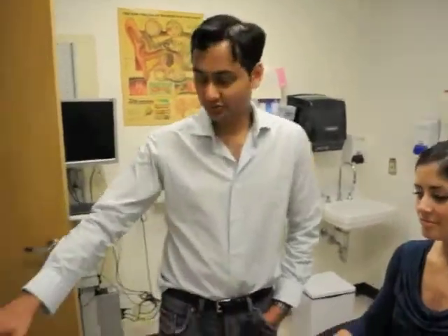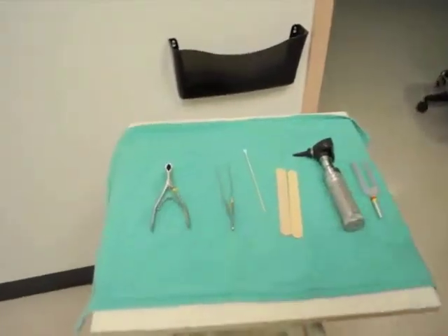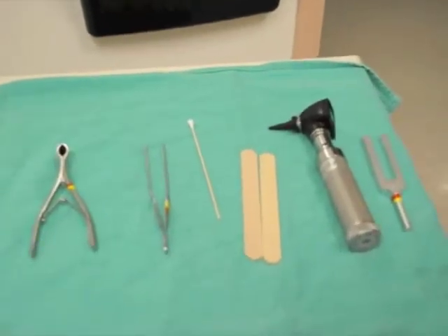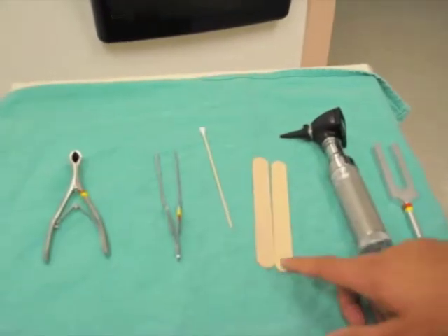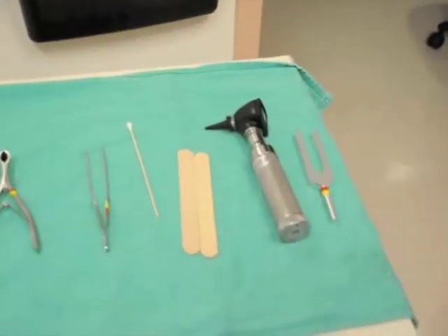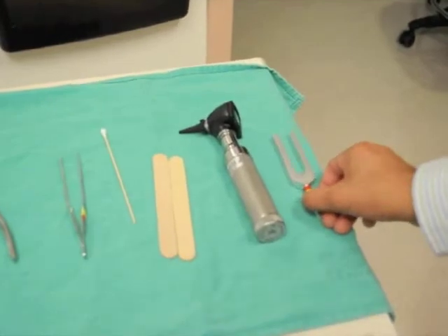We've selected a few instruments here for the Head & Neck Physical Exam. We have a nasal speculum, a bayonet's forceps that is used for nasal packing, a q-tip that we'll use for pointing out structures, some tongue depressors, an otoscope which we'll also use as a light source, and a 1024 tuning fork.